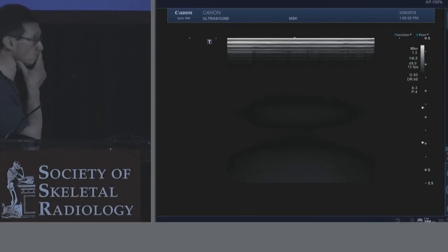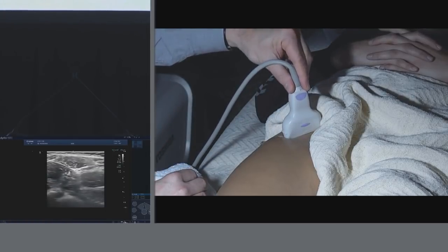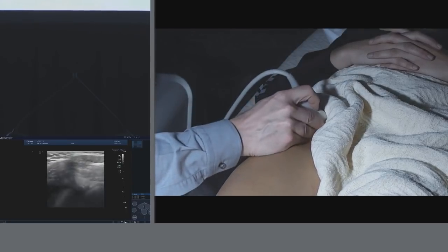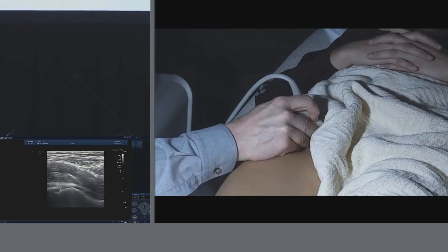Okay, thanks, Ted. The first step will be the anterior part. I'll be showing the hip joint, the anterior musculature, and then also the lateral femoral cutaneous nerve. So as Ted mentioned, the probe is placed in the sagittal oblique plane like this so that we can actually be in line with the femoral neck and the femoral head. So the bony landmark here is obviously the femoral head where we can see the rounded appearance. Here's the acetabulum. Here's the echogenic fibrocartilage labrum.